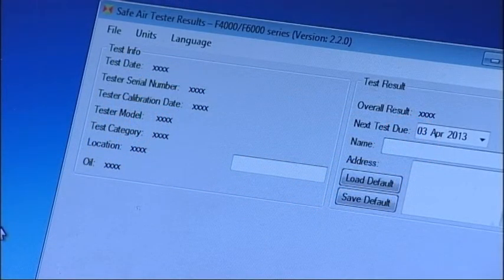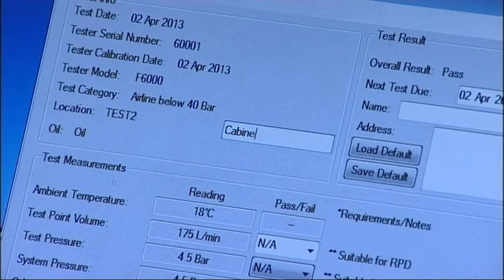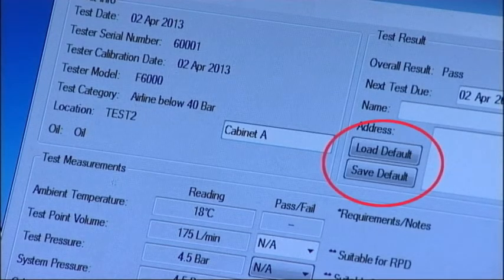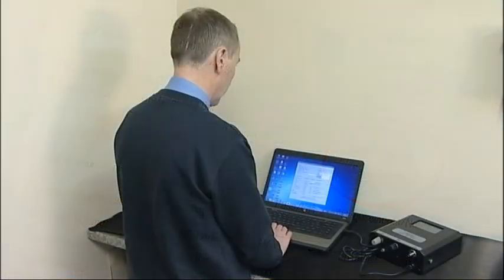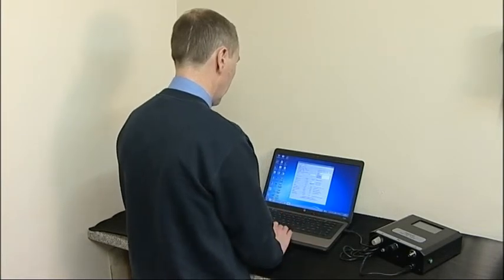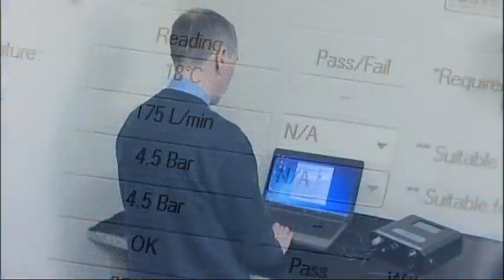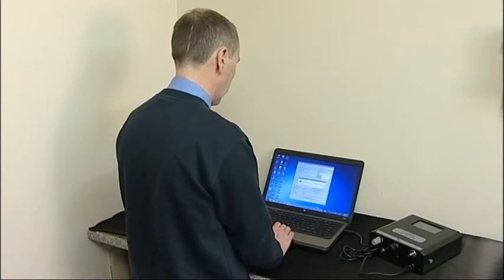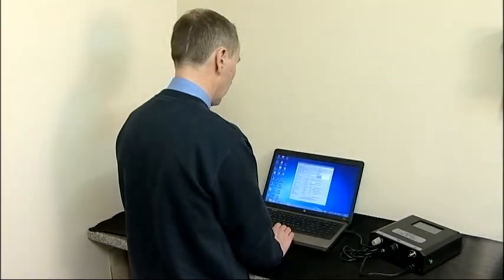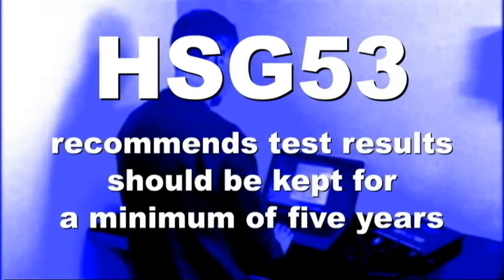Individual test records can be opened from the File drop-down menu by selecting Open a Test Results File. Once loaded, further information can be added about the test location, engineer and their address. The engineer and address details can also be saved as a default. For each test, you'll need to confirm whether the recorded test volume and pressure was sufficient by selecting Pass or Fail as appropriate. When complete, you can save the test result file and, if required, print off a certificate. In the UK, Health and Safety Executive Guideline HSG 53 recommends test results should be retained for a minimum of five years.